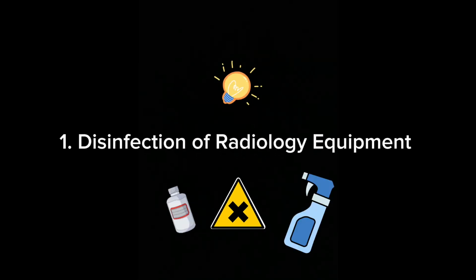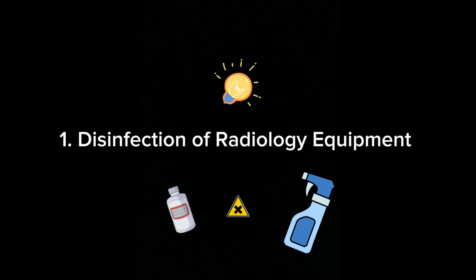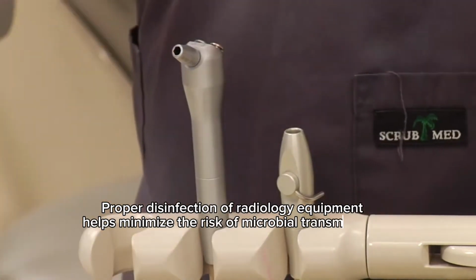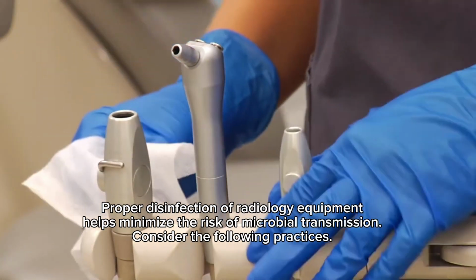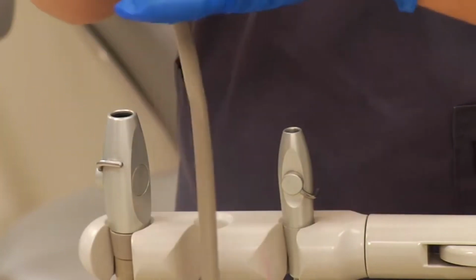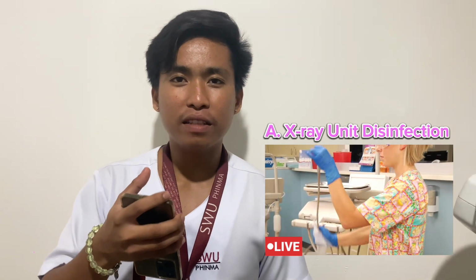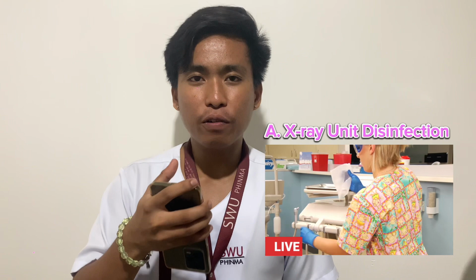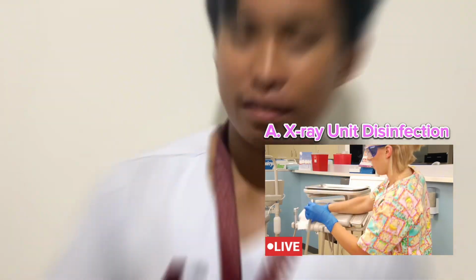Number 1. Disinfection of radiology equipment. Proper disinfection of radiology equipment helps minimize the risk of microbial transmission. Consider the following practices. Clean and disinfect the exterior surface of X-ray units regularly using appropriate disinfectant wipes or solutions. Pay attention to areas that are frequently touched, such as control buttons, handles, and support structures.